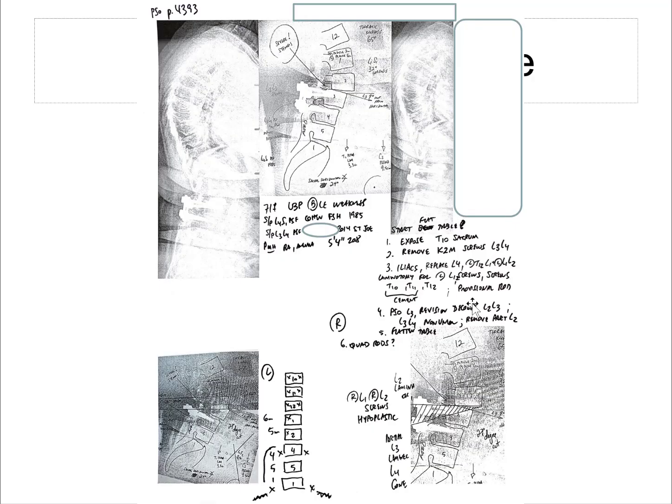And this is my preoperative plan. Basically, before every operation, I have exactly every single step that I have to do for the whole surgery. The reason is, when you do these cases, you get tired and you don't want to miss a step. So if it's written down and printed and in the operating room, it's very easy. You go up to it and look at it if you get tired or if you forget, just to confirm you did everything right.